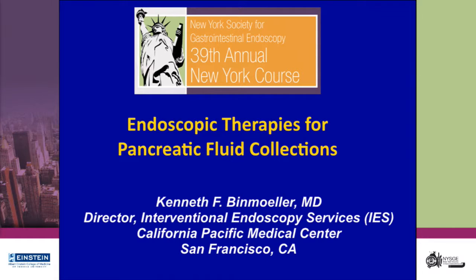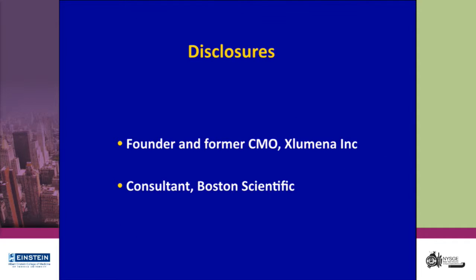I've been asked to speak on endoscopic therapies for pancreatic fluid collections, and I have to say I find drainage of pancreatic fluid collections one of the most gratifying procedures. It's like removing a stone in a patient with cholangitis. You can give these patients immediate relief of their symptoms.